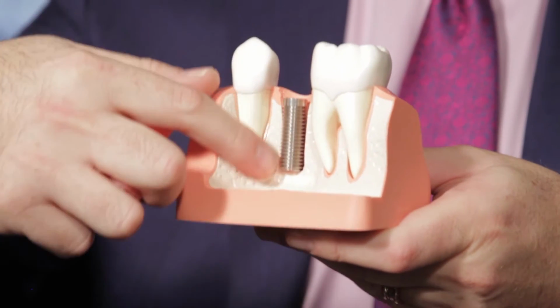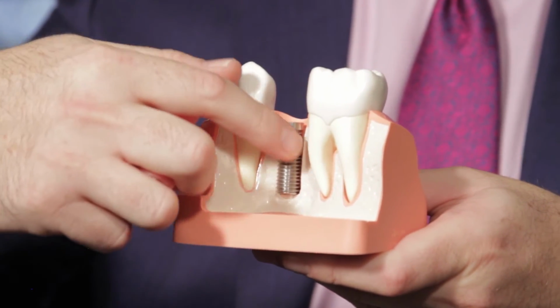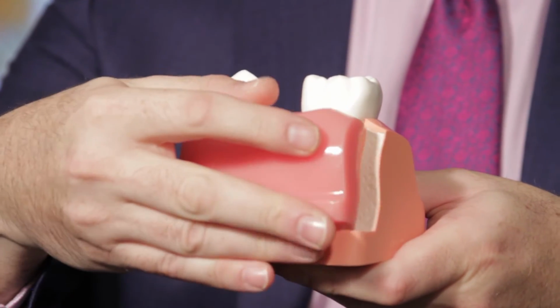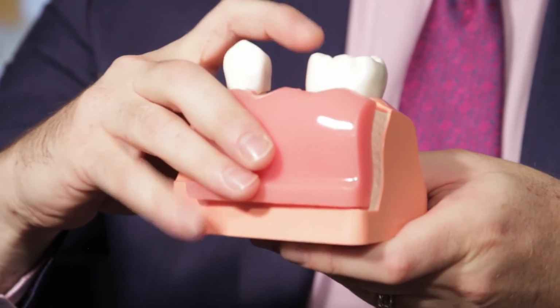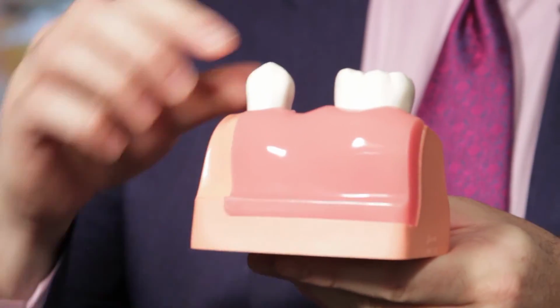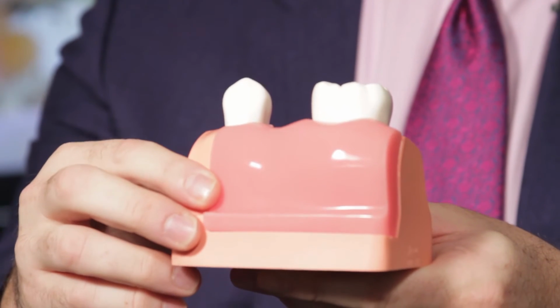So if a patient comes in and they are missing a tooth, the first portion is to remove the gum or open the gum next to the tooth, and then an implant is placed, which is a titanium structure which resembles the root of a tooth, into their jawbone. After this is done, then their gum is replaced over the area, and then the patient would leave with this area where the implant was placed suture closed. Most of the time they are not seeing their implant.